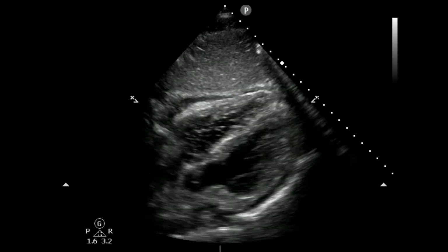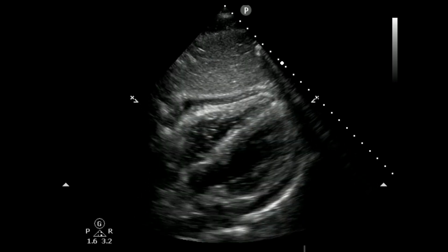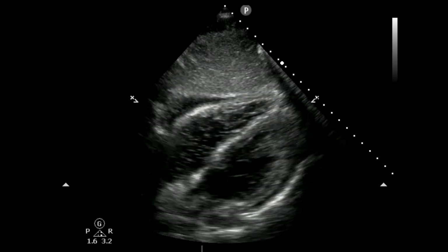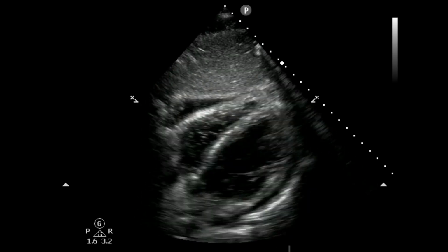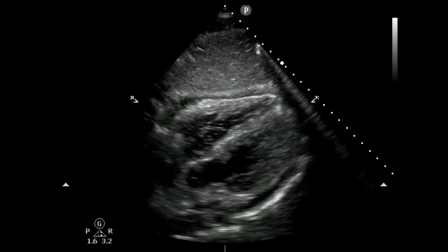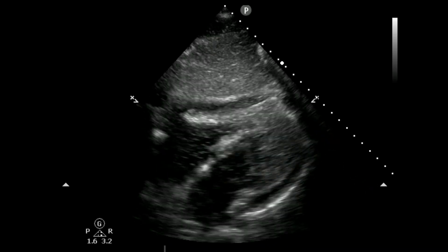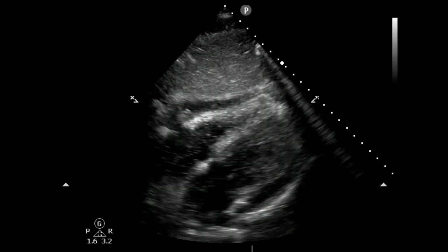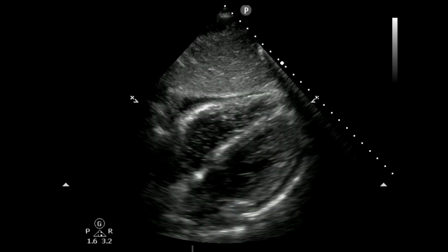So if you go back and think big picture to what my priorities in trauma are, right? I get a patient on the table, EMS brings them in, they tell me what happened to them. They have a blunt or penetrating injury, whatever the case may be, and they're hemodynamically unstable. As part of my workup, I'm going through this primary survey searching for potential causes of their hemodynamic instability, or potential life or limb threats that I need to intervene upon right now that I can't defer until later. And so the first question is, why are they hemodynamically unstable? Because I need to intervene upon that because that might be getting worse.